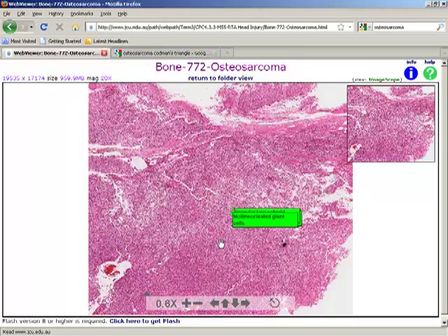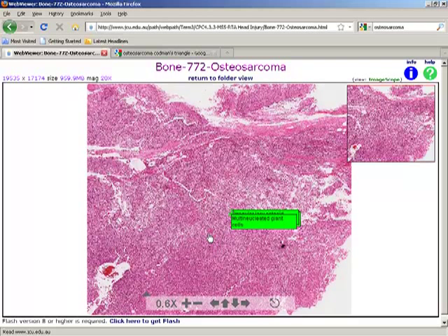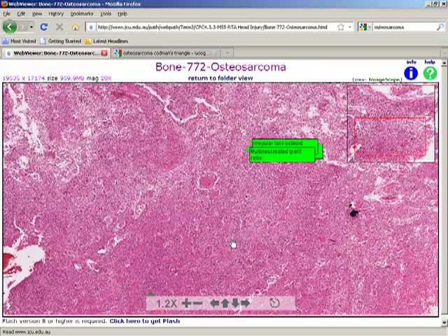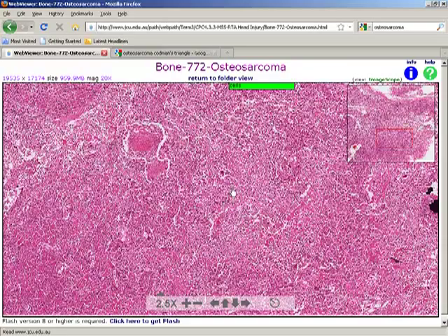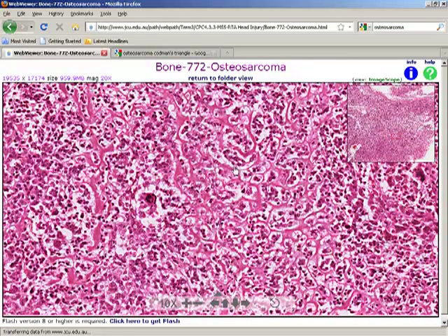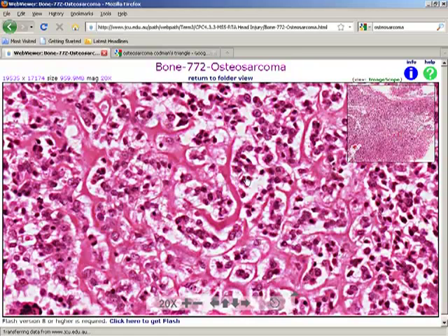So as a pathologist we would expect on microscopy, whether it is fracture or whether it is a tumor. Now, if it is a fracture, you would see woven bone, inflammatory cells, granulation tissue, whereas in a tumor, you see this. All the cells look like inflammatory cells, but if we see high power, they all look alike. They are all similar type of cells.